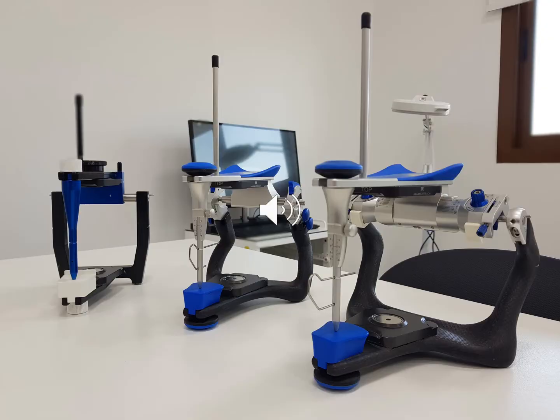Now here in this photo we can see more sophisticated articulators that are meant to resemble our stomatognathic system in a closer way, but they have different degrees of adjustability. So size-wise, they are close to our stomatognathic system size, okay? And from left, we have an average value articulator, or in this case, it is a mounting articulator that is not allowed to move to the right or the left, just open and close, but to have the same size or similar size to the average of human's stomatognathic system. In the middle, we have an adjustable articulator, which we call semi-adjustable articulator, and to the right side we have a more adjustable articulator.